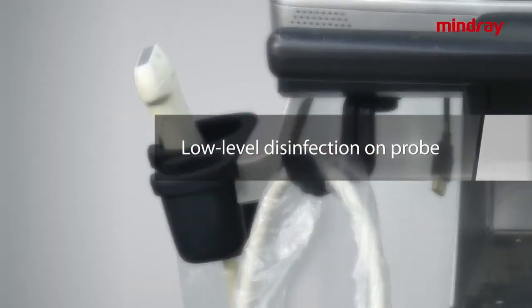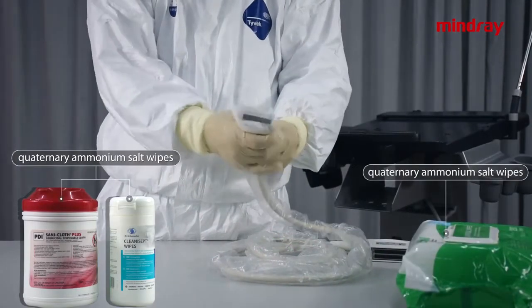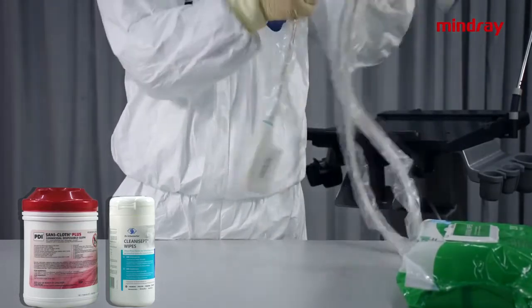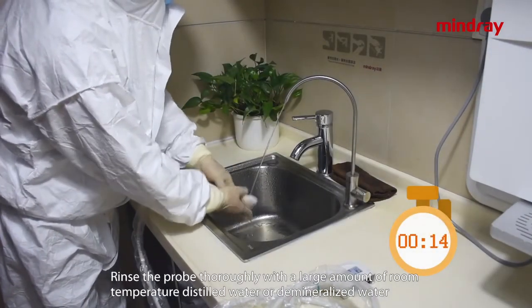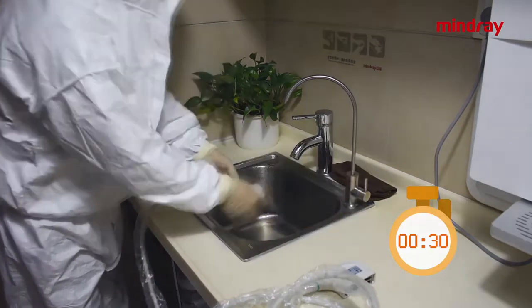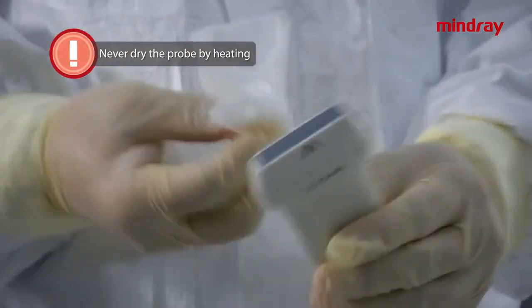Low-level disinfection on probe. Wipe the probe with quaternary ammonium wipes. Rinse the probe thoroughly with a large amount of room temperature distilled water or demineralized water to remove the residual disinfectant. Rinse for about 30 seconds. Repeat twice. And wipe the moisture on the probe with a disposable soft lint-free cloth or paper towel. Caution: never dry the probe by heating.